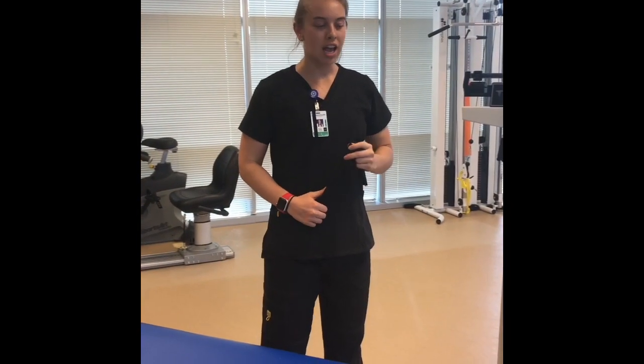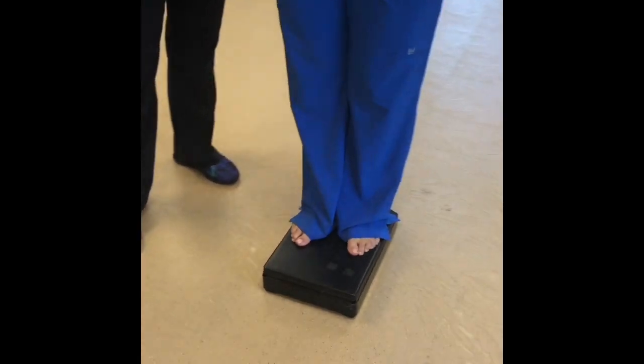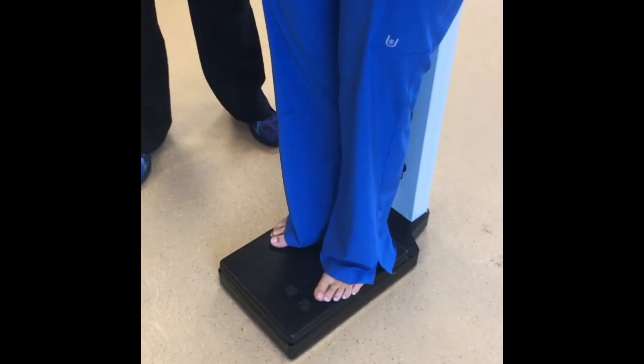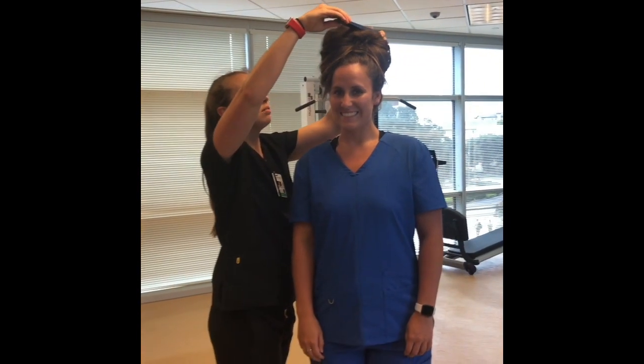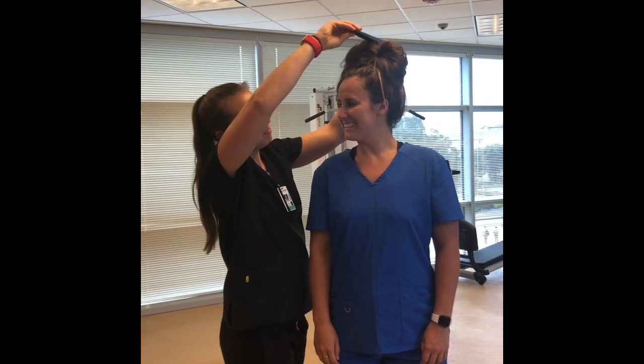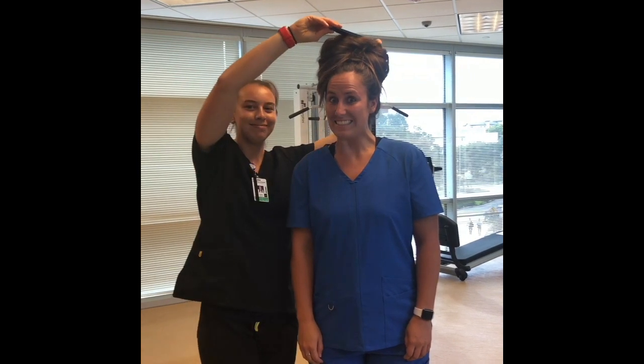To measure height, you're going to have your patient step on the scale, have them scoot all the way back, and then angle those feet out at about 60 degrees. Next, you're going to take that horizontal bar and you're going to put it to the, ma'am, I'm going to need you to remove your bun. Make sure you have the patient remove all buns, braids, and hair clips from their hair before measuring the height.